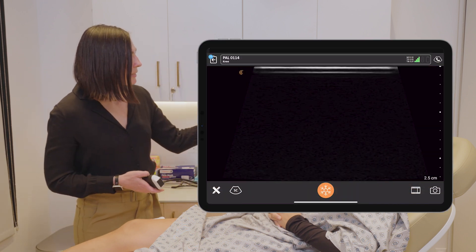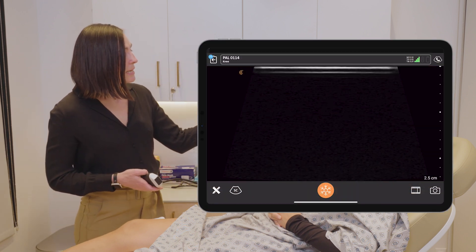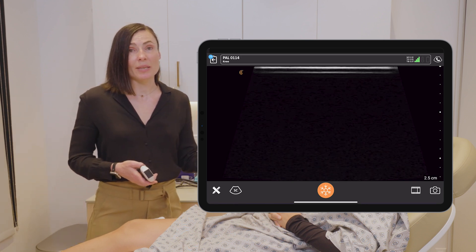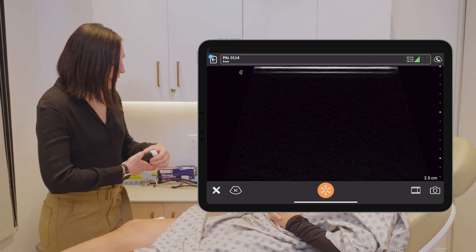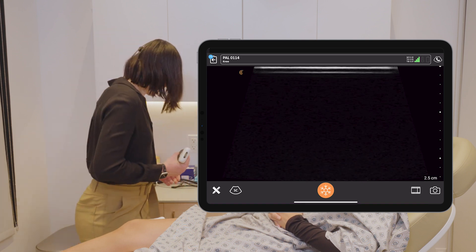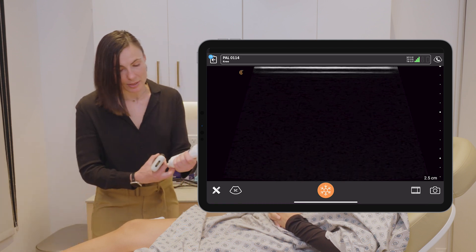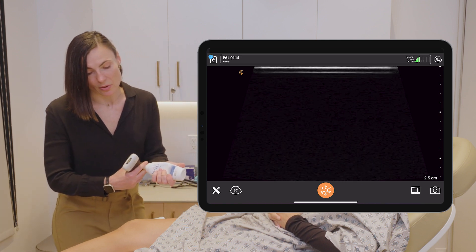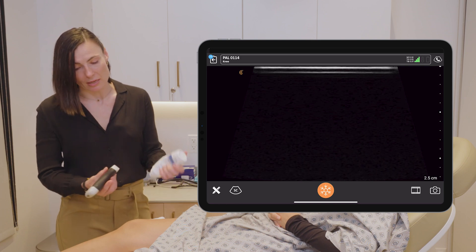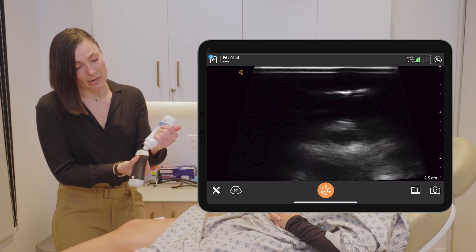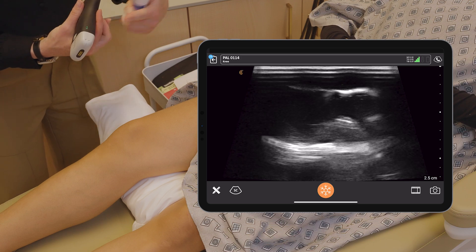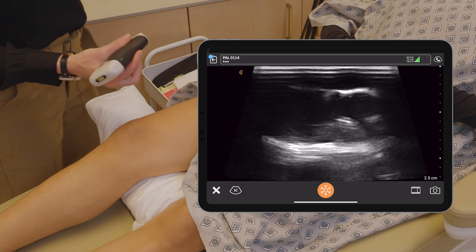I have already selected the knee application, or you can also use the musculoskeletal application on your settings. We are going to look at the suprapatellar portion of the knee in the sagittal orientation, so my probe marker is going to be pointing towards the patient's head.